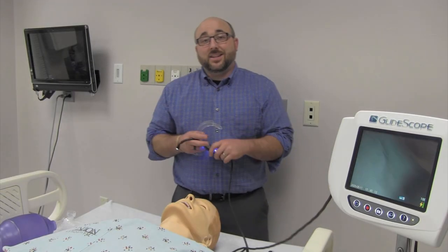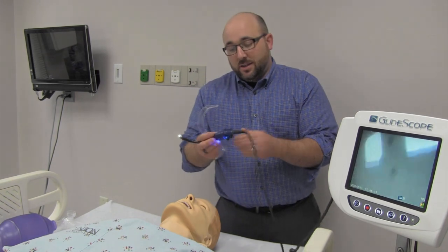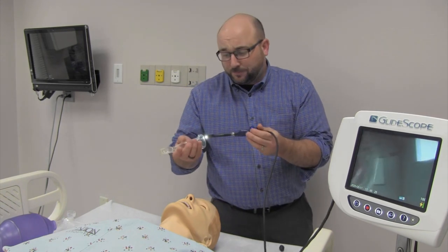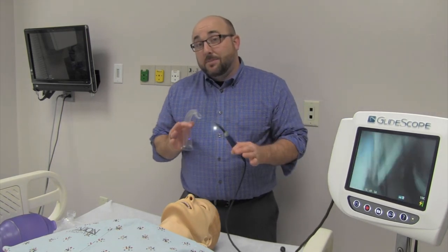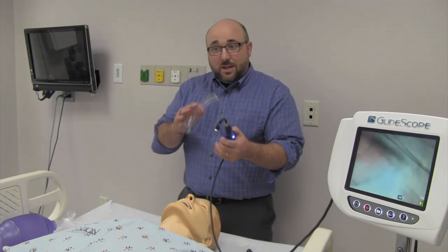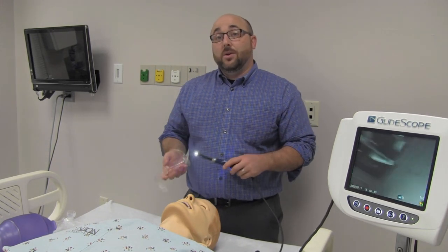Today I've got the GlideScope with disposable GVL covers that go over top of the camera. This is the GlideScope you're probably most used to — not the newest version but pretty new. We have a nice size screen and I'm going to show you a quick, methodical way of intubating with this. Even if you think video-assisted makes it easy, it can be hard. This is a different set of skills from direct laryngoscopy.